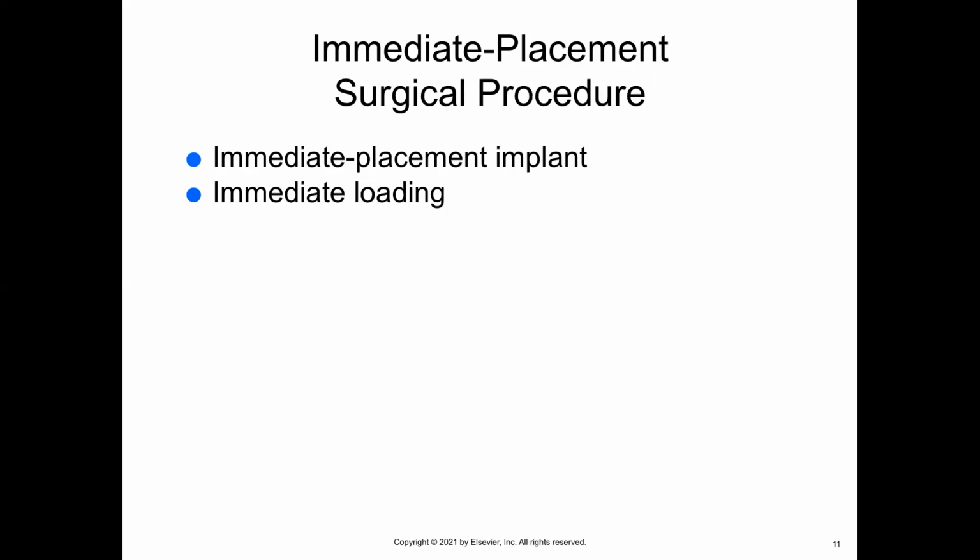So there is a screw retained implant, and this allows for the implant crown to be easily removed if necessary. If the crown ever becomes fractured or loose, the screw can be loosened to take it off and possibly have a new one made. So the screw must be tightened properly to prevent it from coming loose, but not too tight as to where it can cause the material to break.